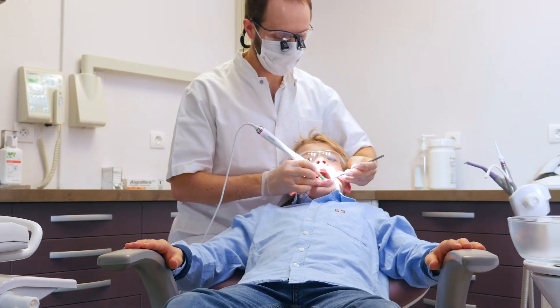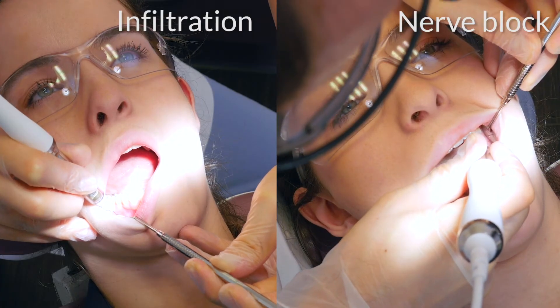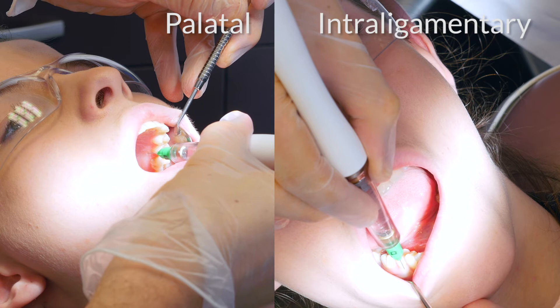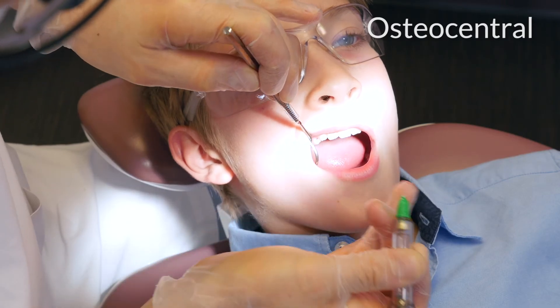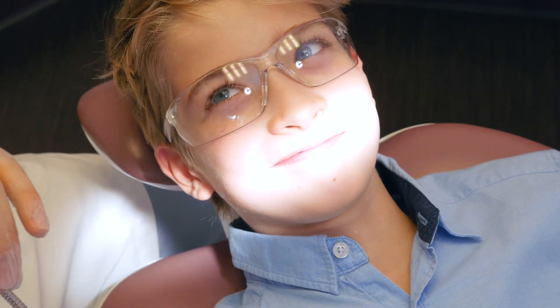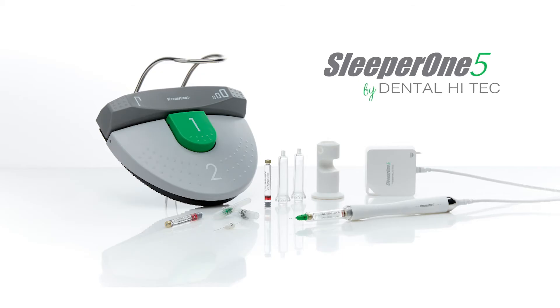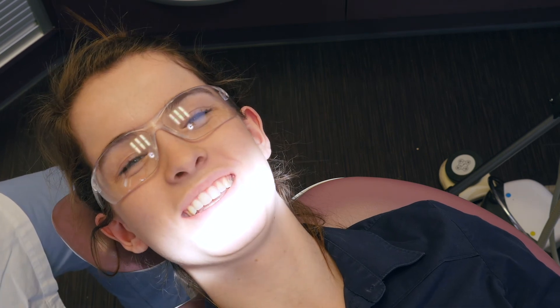Three injection modes provide success for all your anesthesias: infiltration, nerve block, palatal, intraligamentary, intraseptal, and even osteocentral in young children, to eliminate numbness and the risk of biting. Sleeper One Five combines simplicity, performance, and comfort for you and your patients. With Sleeper One Five, the syringe of today is no longer a syringe.